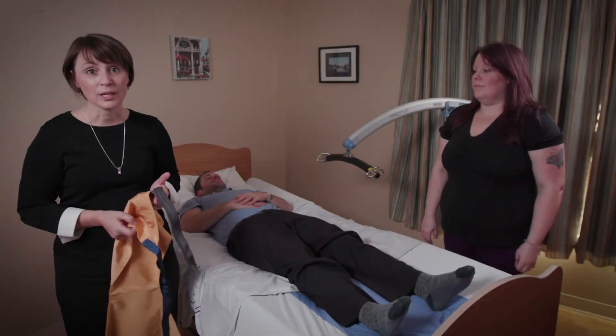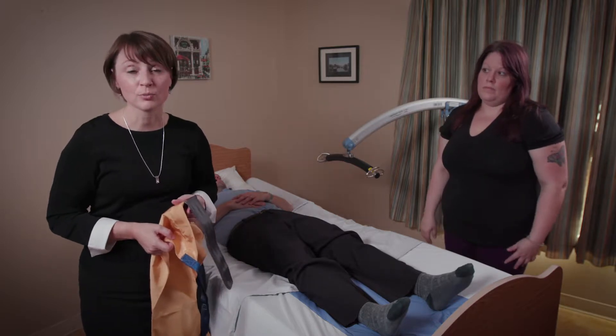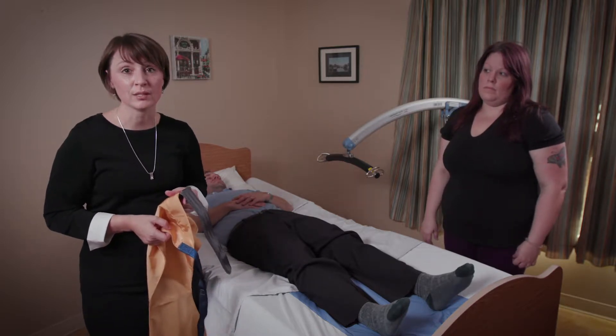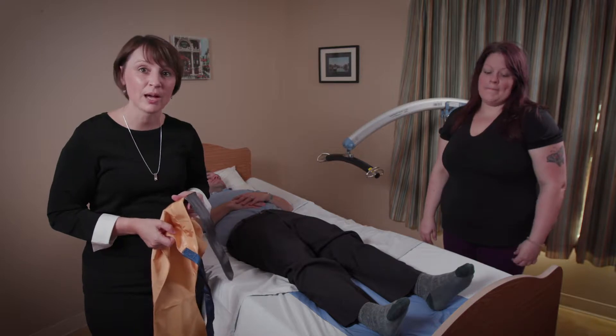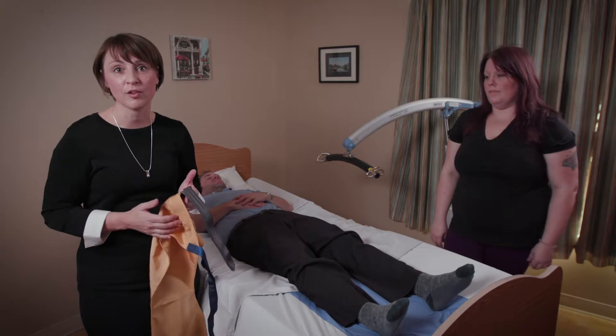So what's the maximum amount of weight that you should be lifting that's considered safe? Well, as part of our PACE rollout training and safe handling mobility, 35 pounds is the limit. But the question is, well, what is 35 pounds? How do I know how much is 35 pounds?